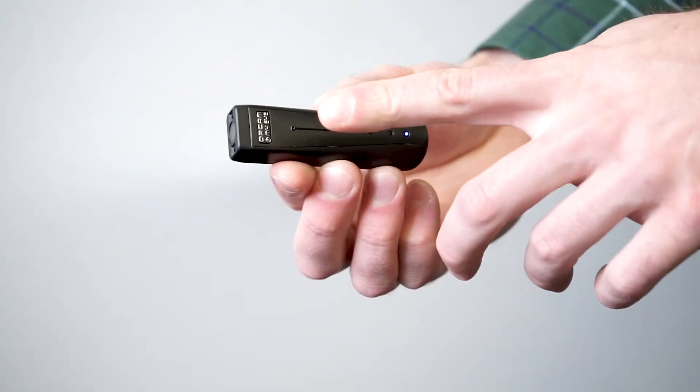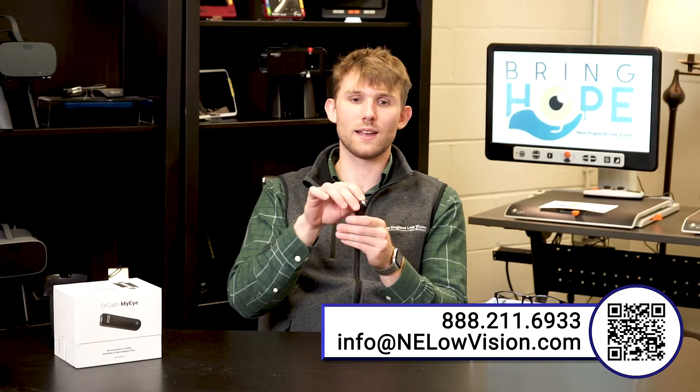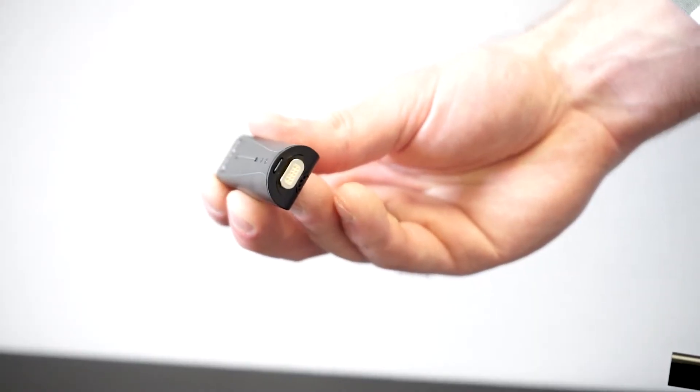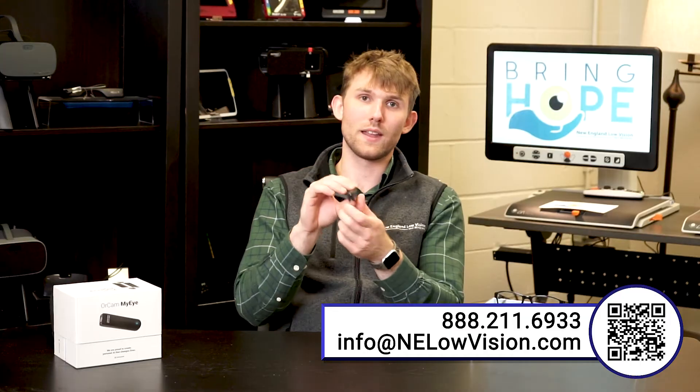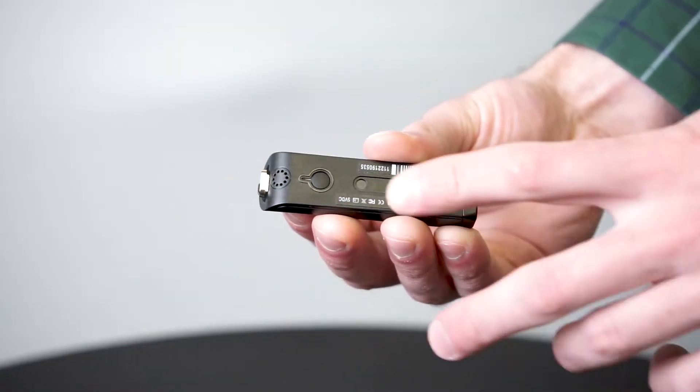It has a touch pad on the side, and on the back is the charging port. This magnetic charger allows you to snap the charger on — great for people with low vision so you don't have to find the port. On the underside, we have the power button as well as a little speaker that shoots right into your ear, so you're going to be able to hear everything the OrCam MyEye is saying.